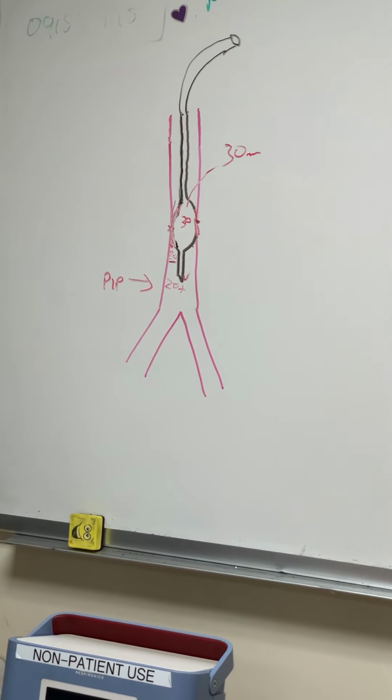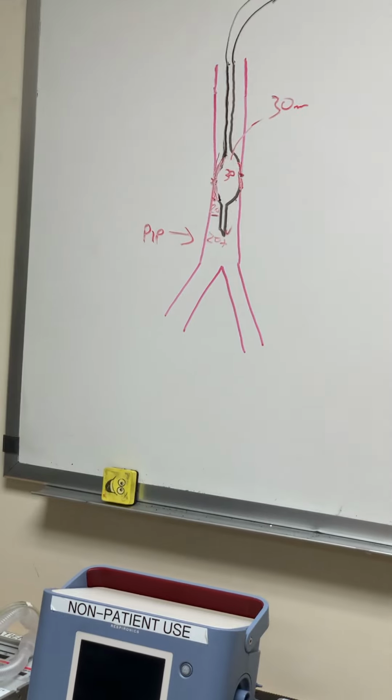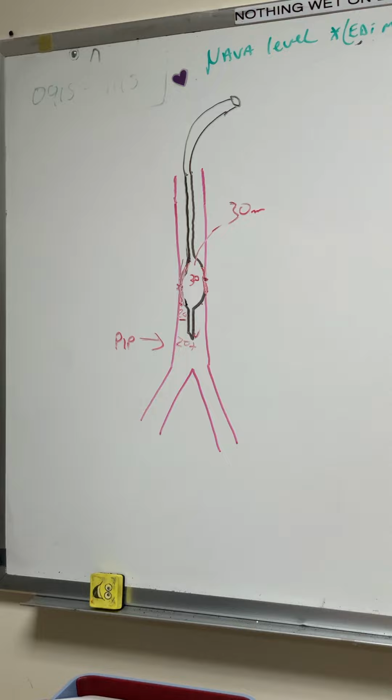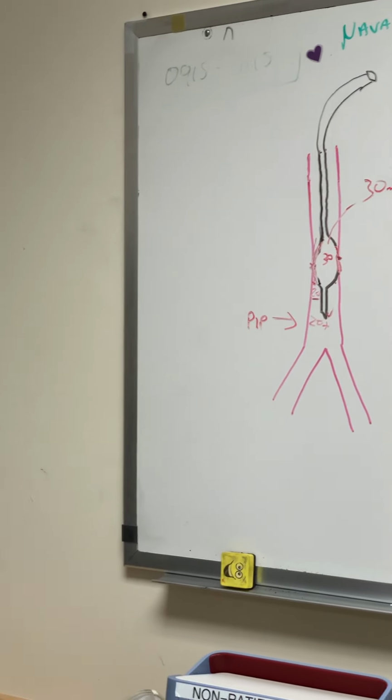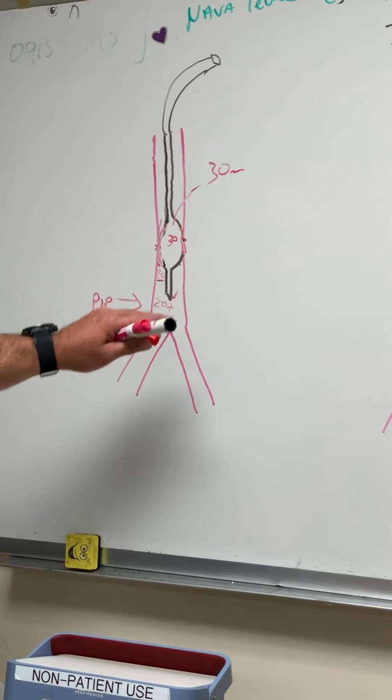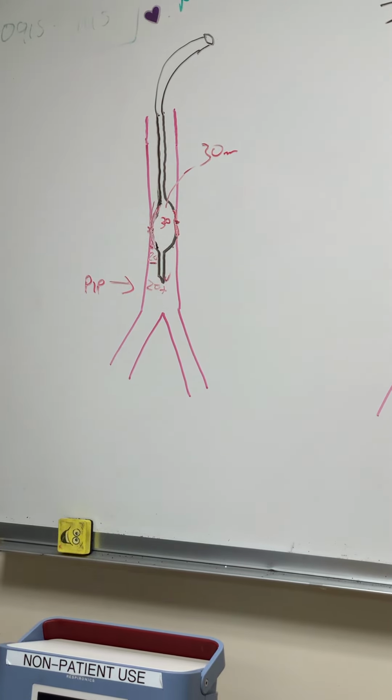It's not the right size airway for the patient. A lot of things could happen. It could be the right size for the age, but he could have an enlarged tracheal wall. I mean, there are abnormalities that would cause this, but ultimately the airway could be too small for the patient's airway. So we're requiring more pressure in the cuff.